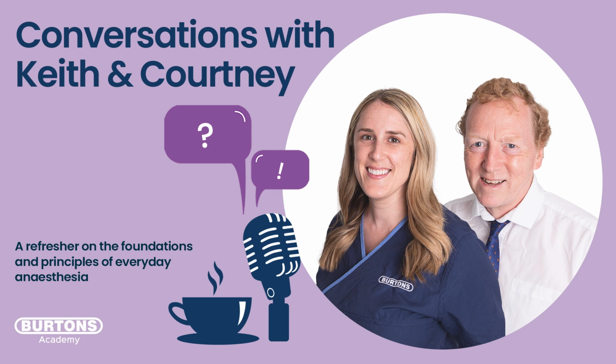No, not for the one-off breath. Yes, right. You put your cat on and it goes up to 18. You haven't just destroyed its lung. It's just a slight overpressure, and everything will be fine. Continually ventilate it at 18, yes, you possibly lead to some problems.